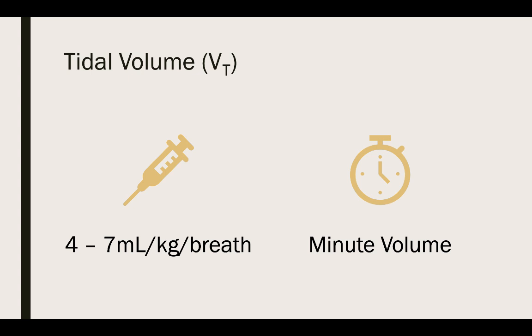So real quick calculation just to do there. Again, we're going to set it, see how our patient responds to it, and kind of go from there, right? So we're still looking for good chest rise, adequate chest rise, and we'll adjust as needed.